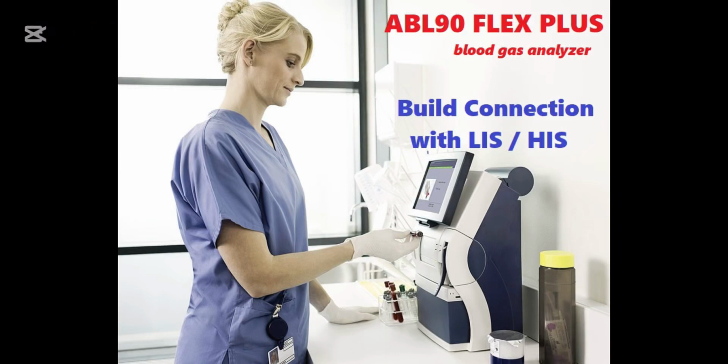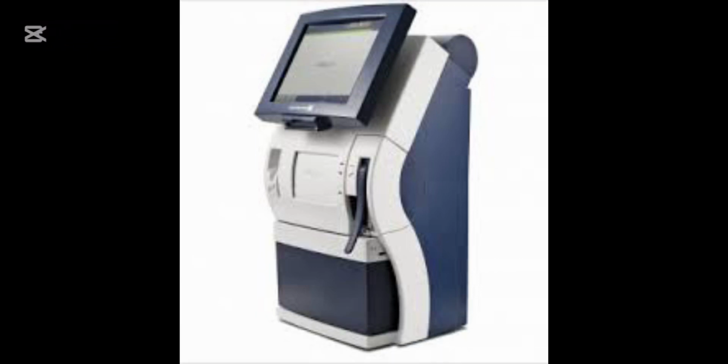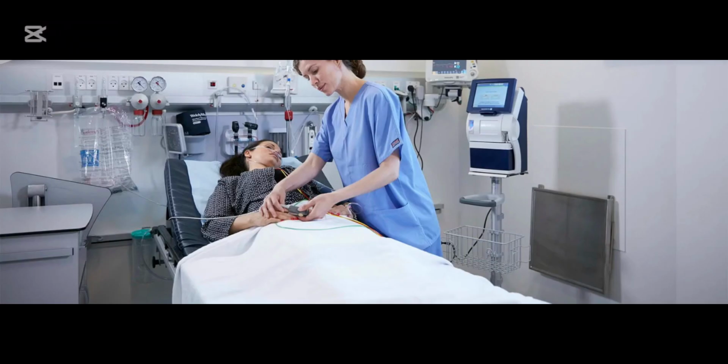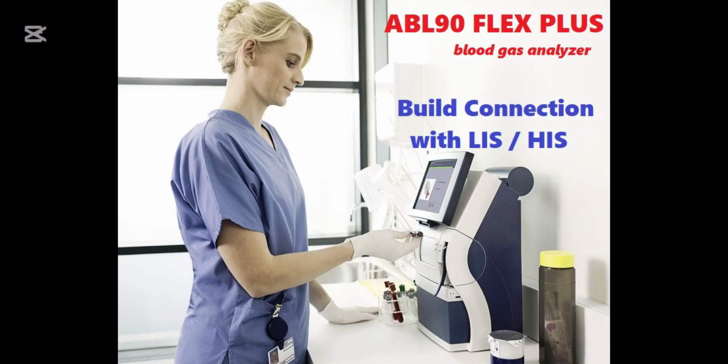So today my video is about the ABL90 machine. As you can see in the video, this is an ABL90 Flex machine used for blood gases tests in a lab. So my video is for lab technicians and for biomed. In this video we will configure this machine with the server and the software. In detail, we will check how we connect this machine with the LIS server and how data is transmitted from the machine to the server. So let's start our video.